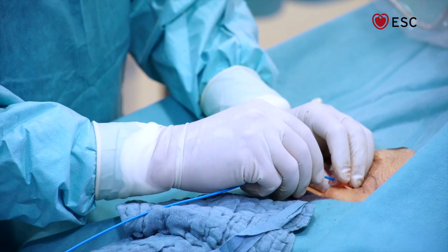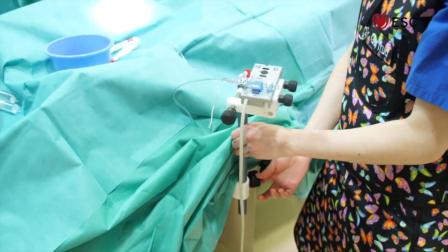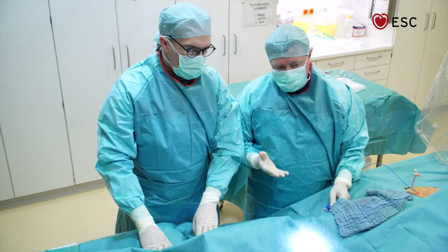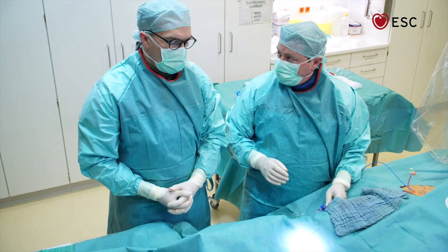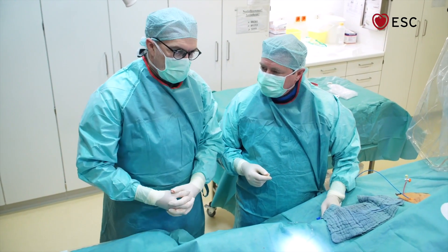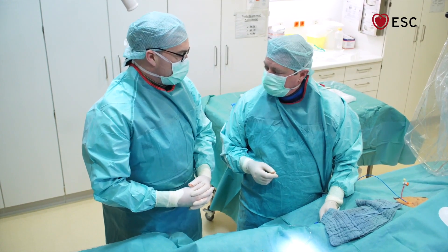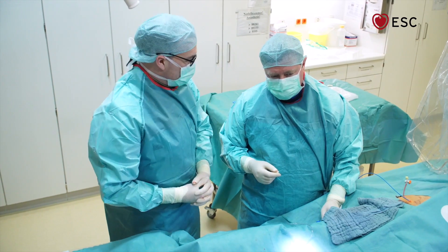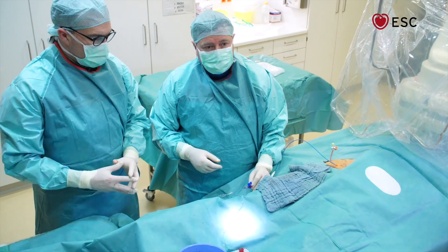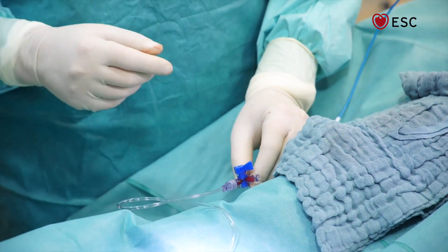I push the catheter further in until the balloon reaches a stable position. Now we get everything connected. It's important that the transducer is at the correct height and that we do a proper zeroing. There is a critical cut point between pre- and post-capillary pulmonary hypertension at 15 mmHg, so getting the zero right is absolutely important. The standard is to have the zero point at the mid-thoracic level. We open the system to atmosphere for calibration — and now we have proper zeroing. Then we start recording the pressure.